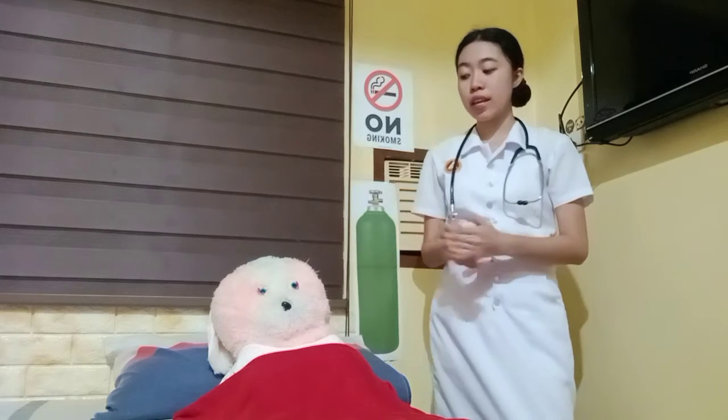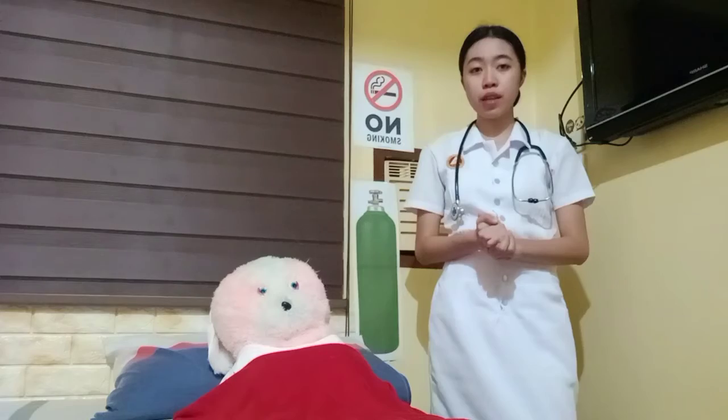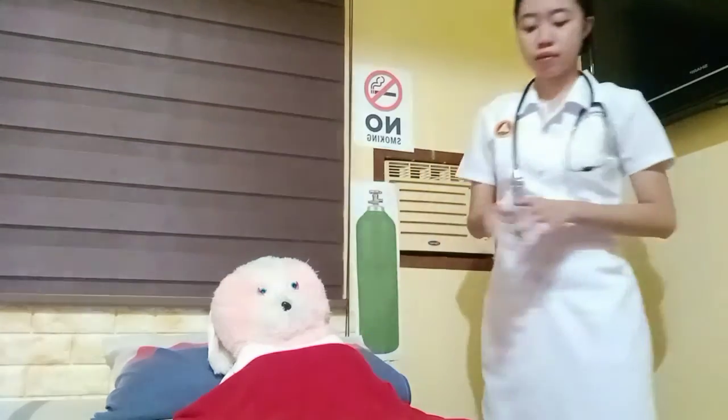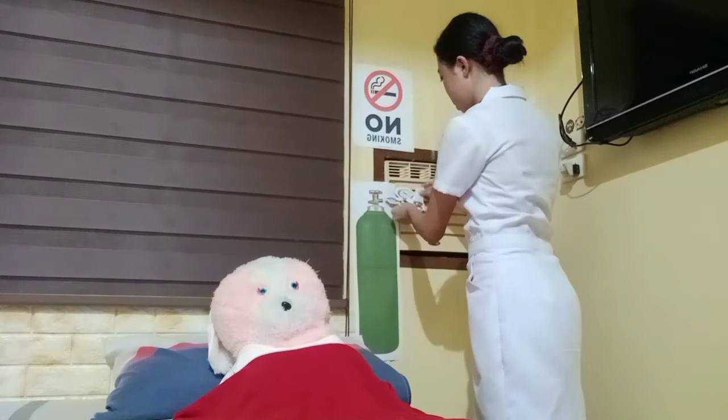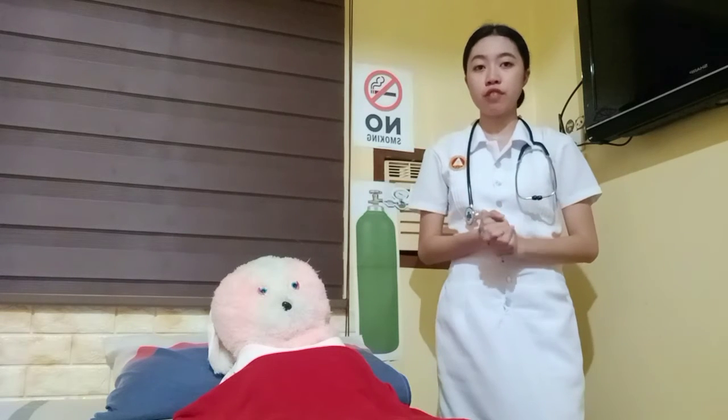Next, assist the client to a semi or high Fowler's position if tolerated. And then insert the flow meter into the wall outlet or oxygen tank. Attach the oxygen tubing to the nozzle of the flow meter.